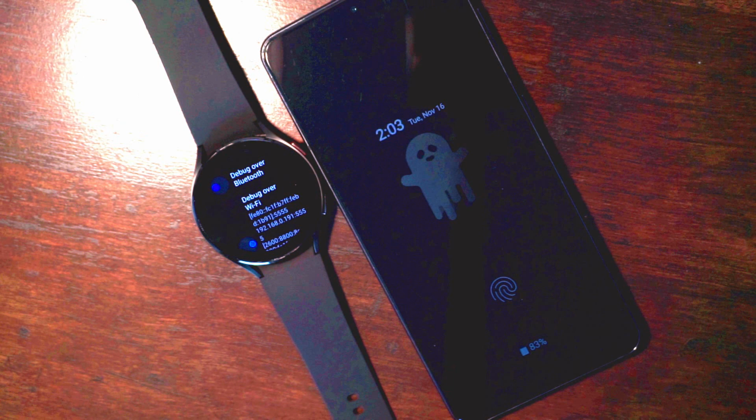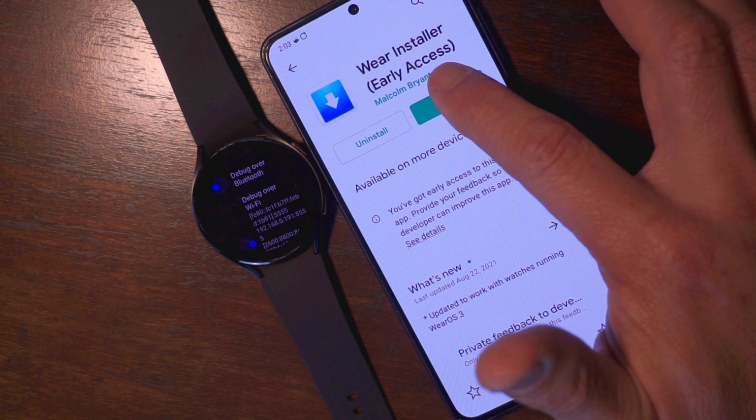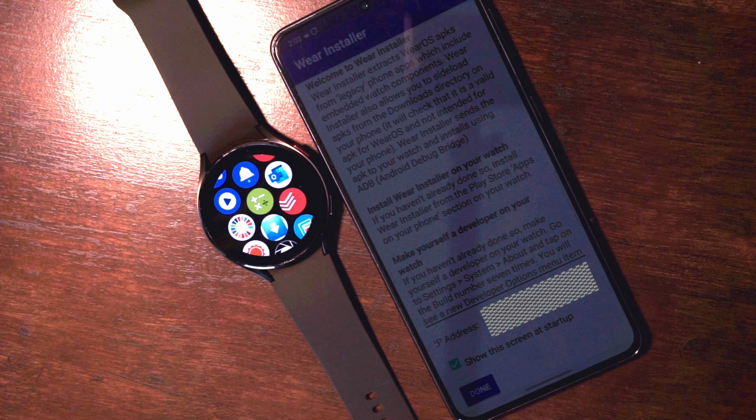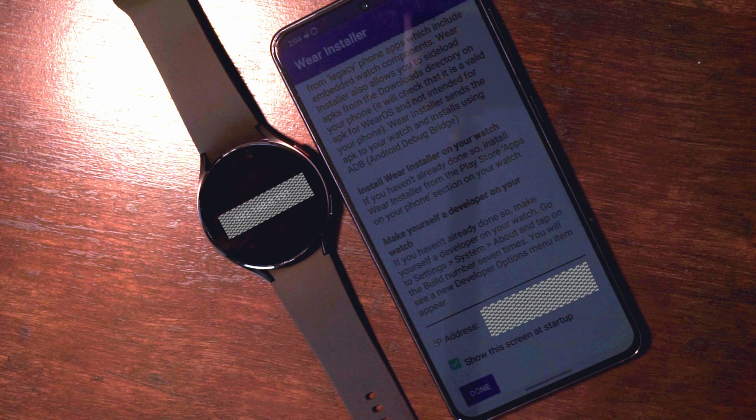Next, you're going to go to the phone and open up the Wear Installer app. And towards the bottom, you'll see an IP address. Open up the Wear Installer app on your watch and make sure that the numbers match. If not, type in the numbers so that they match. You should end with a 10-digit number plus 3 periods. I won't give you my number, but it should look like 123.123.0.123. 10 numbers total. Now select the purple Done button, and then it'll move you to the installed apps screen.